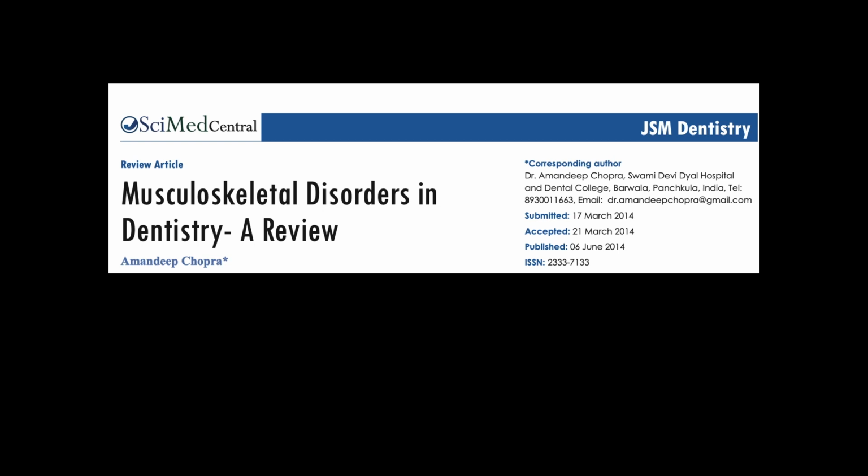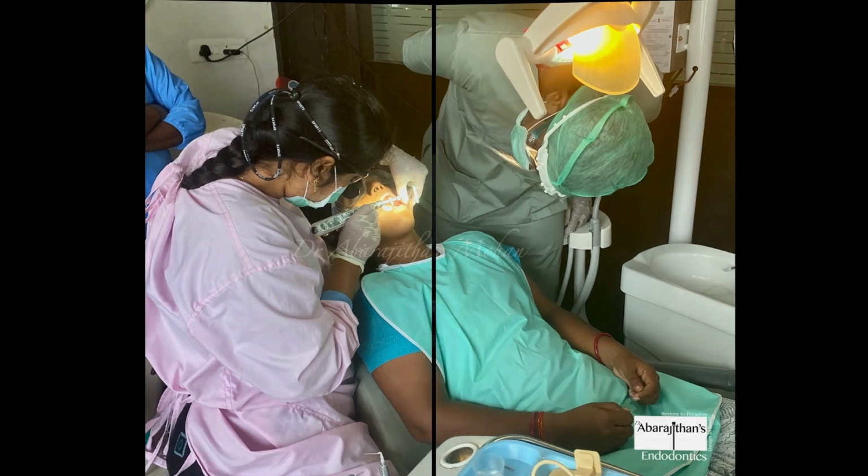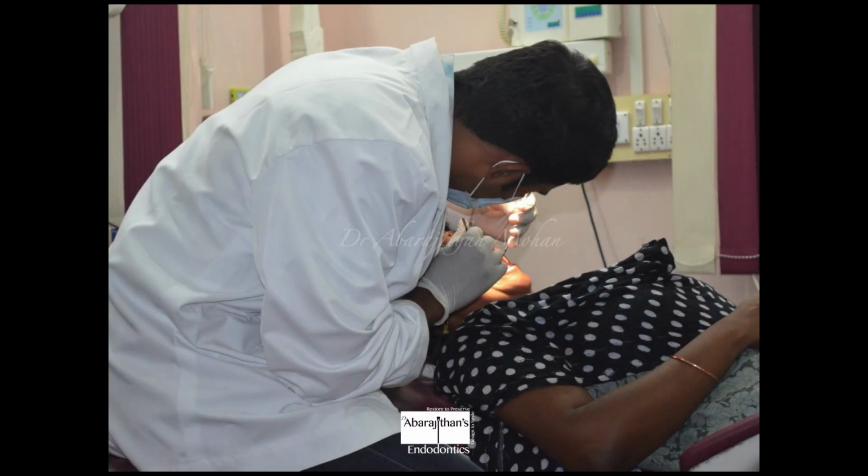In the earlier stages of our life, we concentrate more on the procedure and the procedure outcome, and in the process, we are so keen on locating canals, seeing lateral canals, or the final outcome. We don't care about the ergonomics or the chair positioning or the operator positioning. And in this picture, you can see that very clearly. So these are some of the common errors that we see or we ourselves make in our practice.